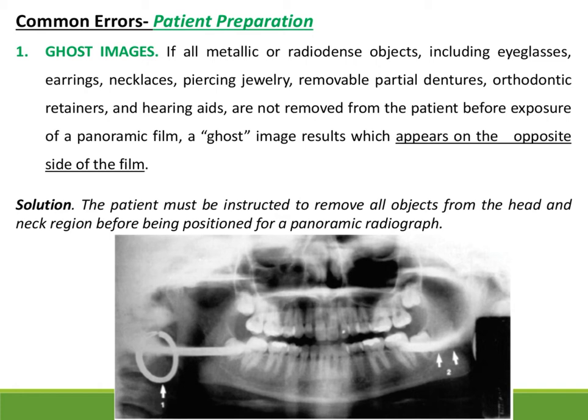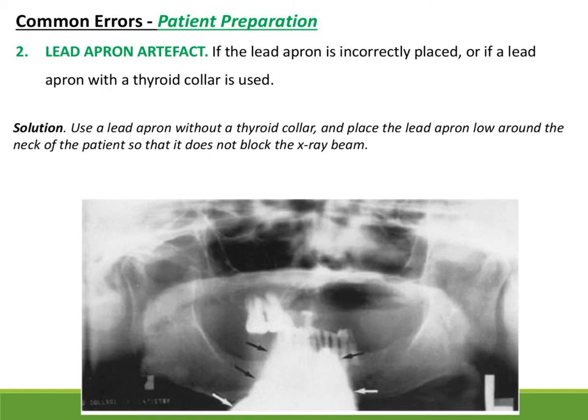Okay. So the problem with ghost images is that it compromises the diagnostic quality. If a dentist doesn't know about the ghost image, then he may do an improper diagnosis and improper management of the case. Okay, so you have to always instruct the patient to avoid the appearance of ghost images on the radiograph.